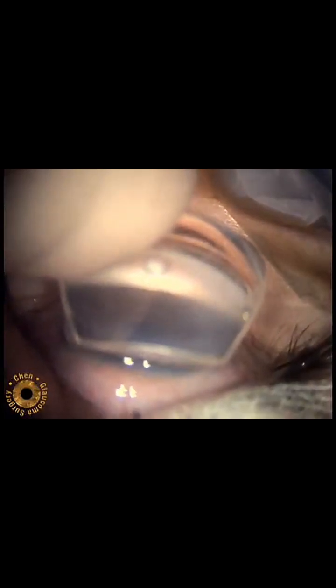The surgeon's left hand is holding the Barkan lens, which has already been placed on the cornea. In the surgeon's right hand is a non-tapered swan goniotomy knife, which is being entered into the anterior chamber through the peripheral cornea. At this point in the surgery, the right-handed surgeon's right hand is actually tilted back towards the surgeon. This is such that when the knife is entered into the anterior chamber and approaches the opposite angle, the hand actually straightens out so that it is in a more comfortable position during the actual goniotomy surgery. For a right-handed surgeon, I find it easier to do the surgery from right to left.